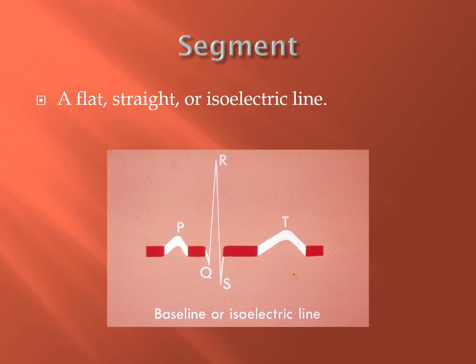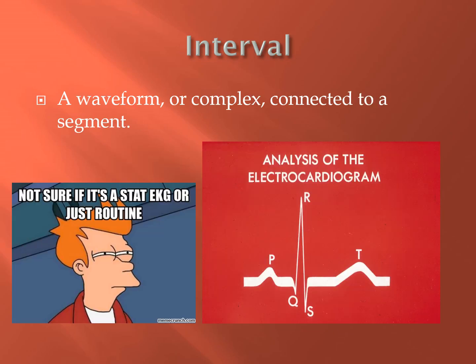So the ST segment is going to be the more important segment to us, and we're going to talk about that more. The ST segment is where we can look at a lot of myocardial injury, especially when we look at what's called a STEMI. An ST-elevation myocardial infarction is called a STEMI, S-T-E-M-I. We'll get more into that, but the ST segment is going to be the big one.